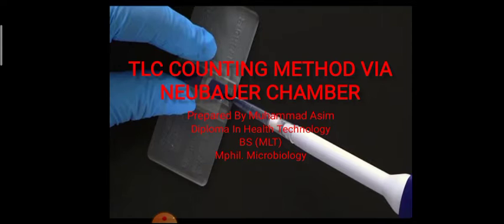This is Muhammad Asim and you are watching my YouTube channel Paramedics Lectures. Dear friends, today I am here to discuss a new topic, and the topic is the TLC counting method via Neubauer chamber. We will learn about the total leukocyte counting procedure via Neubauer chamber, the method we use to count TLC in blood.